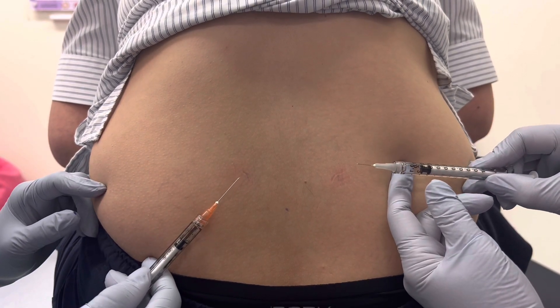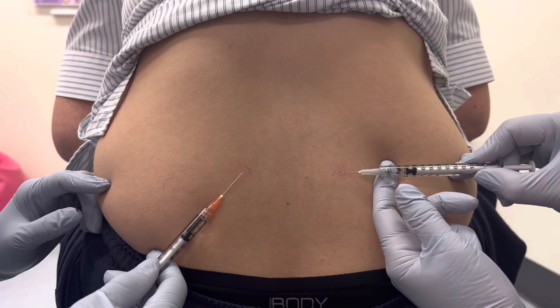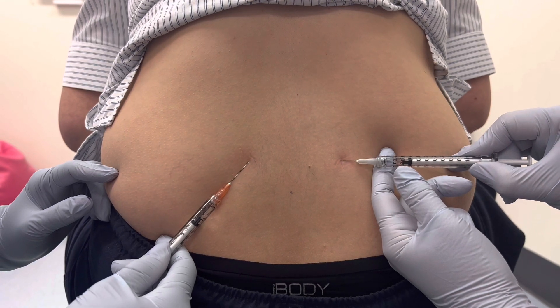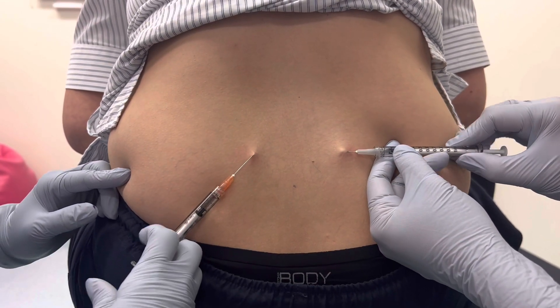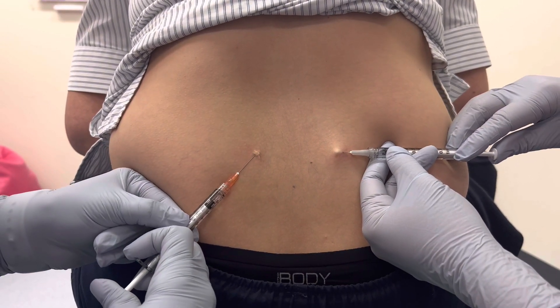What you want to do is inject the needle first — just a little pinch — and then start injecting together.